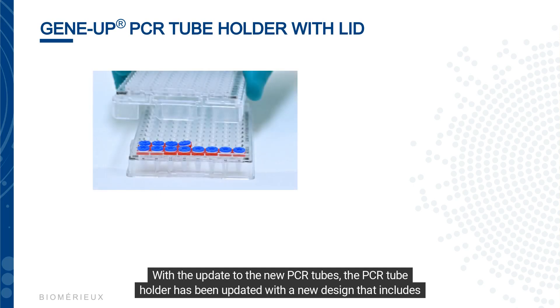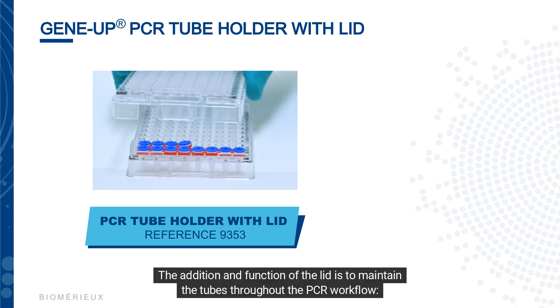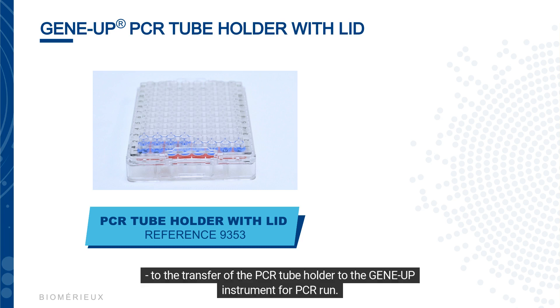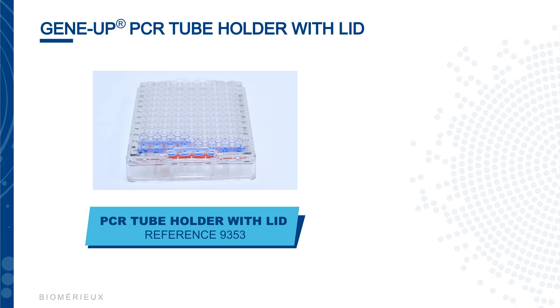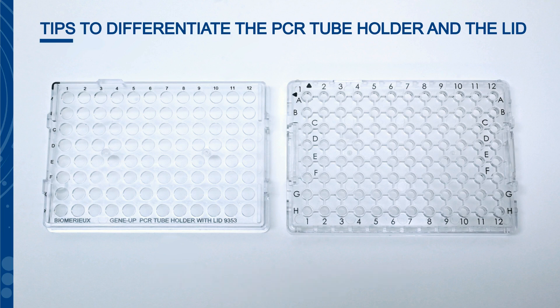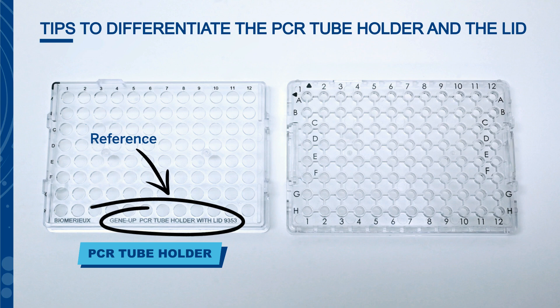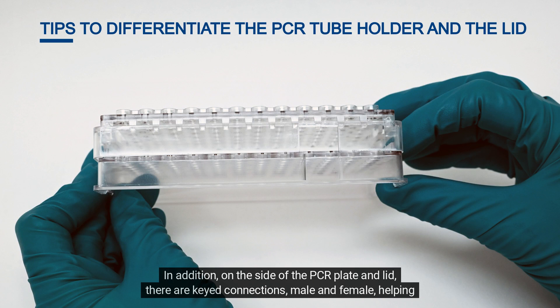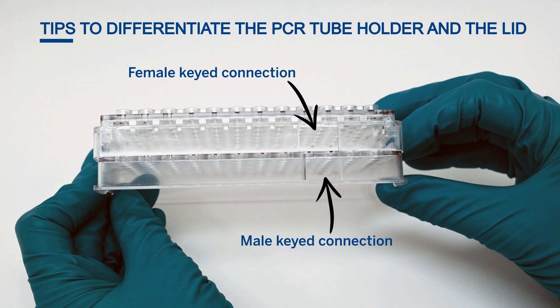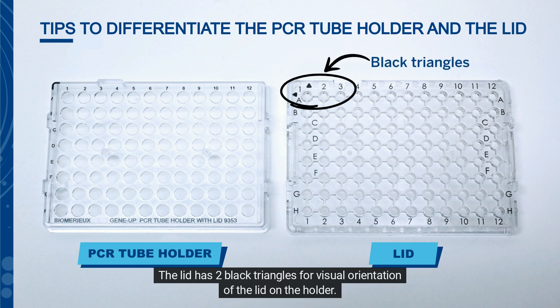With the update to the new PCR tubes, the PCR tube holder has been updated with a new design that includes a lid. The lid maintains the tubes throughout the PCR workflow, from initial pipetting to spinning, removal of the septum caps, and transfer of the PCR tube holder to the GeneUp instrument. The PCR tube holder is identified with the 9353 reference number. On the side of the PCR plate and lid, there are keyed connections — male and female — helping to place the lid correctly. The lid has two black triangles for visual orientation on the holder.